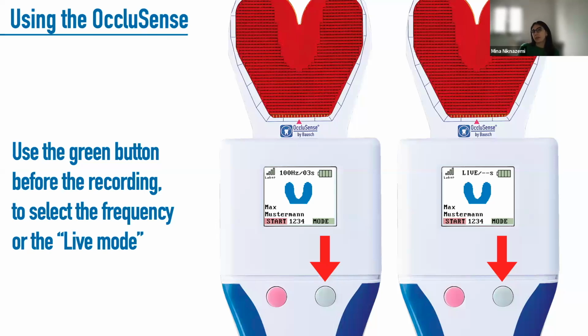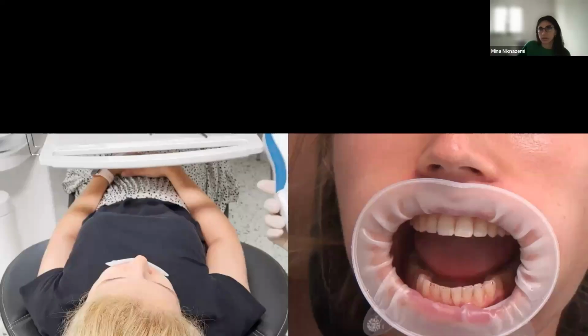Using the green button before the recording, you can also select the time and frequency. So you don't have to do this via iPad. You can also do it via the handheld.